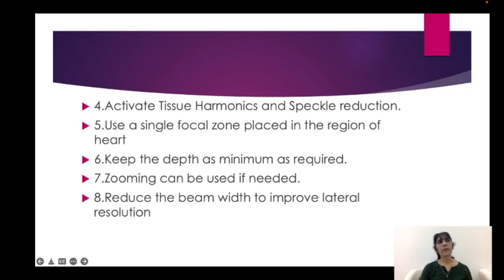But sometimes we need to manipulate, because from patient to patient, things may change. Then it says keep the depth as minimum as required. Basic point that we use even in grayscale, that your area of interest should only be on the screen and a little area beyond that.